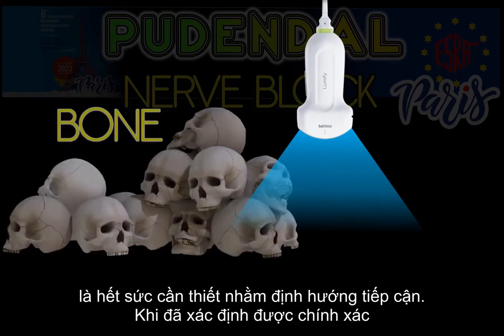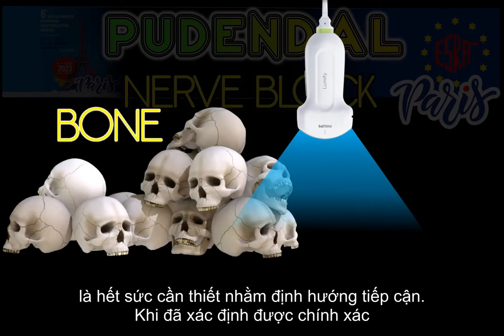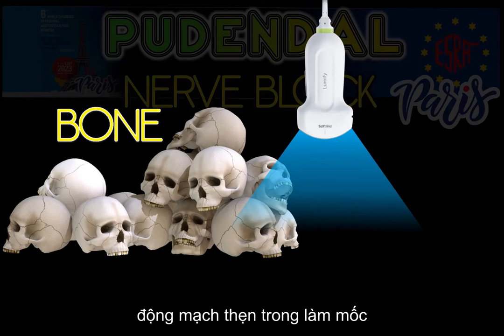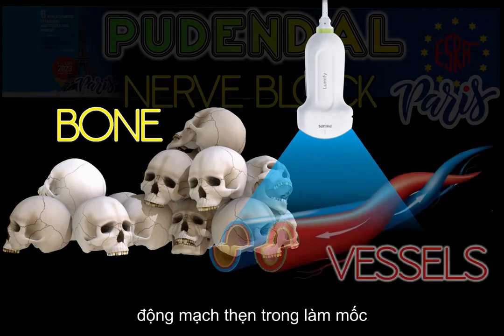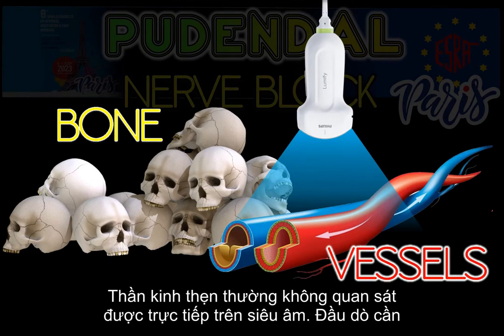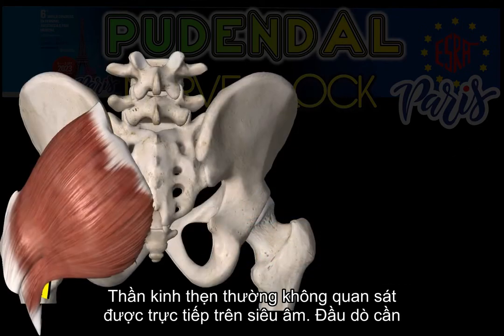For a proper ultrasound scan of the pudendal nerve, it is essential to know certain key bone reliefs, which will allow us to guide our approach. Once we know the exact point of the nerve's path, thanks to these bony projections, we will use the pulse of the internal pudendal artery to direct our needle to its proximity. The pudendal nerve is usually not visible with ultrasound.